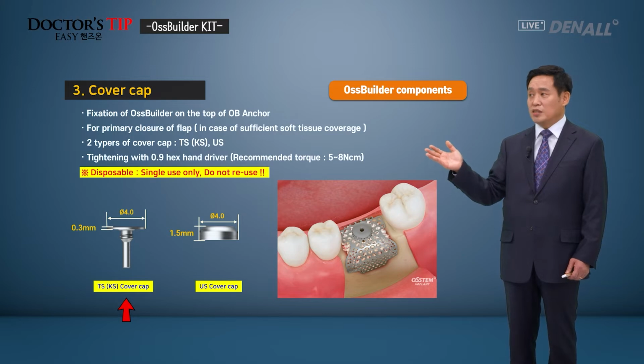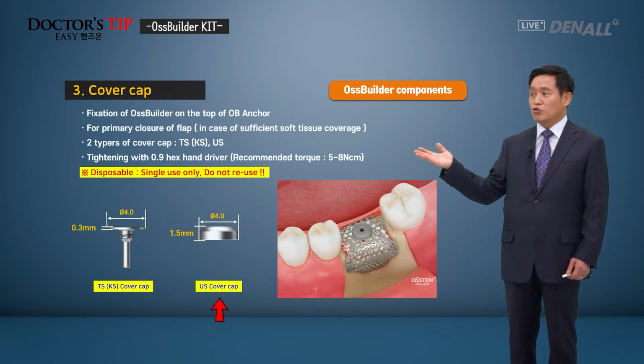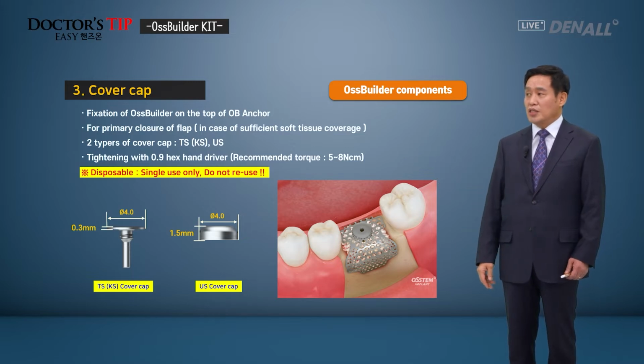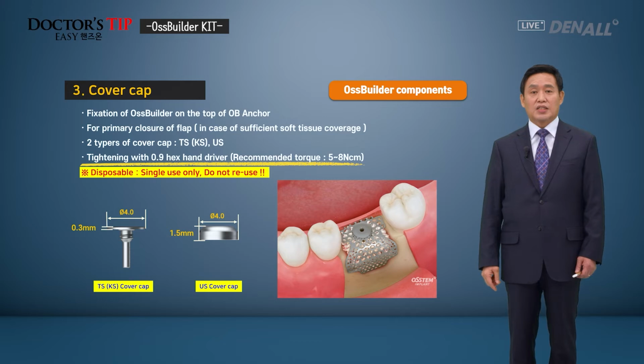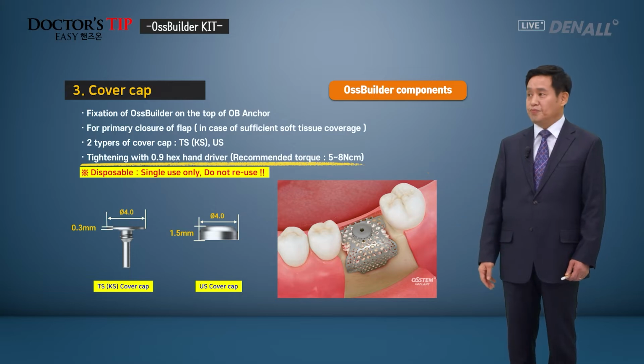Cover cap, you can use TS and KS together, and there's a separate cover cap for US. There is a hexa on the top for US type, so it's a bit thick. The cover cap, when you use 0.9 hexa driver, you'll be able to easily tighten it and apply it.